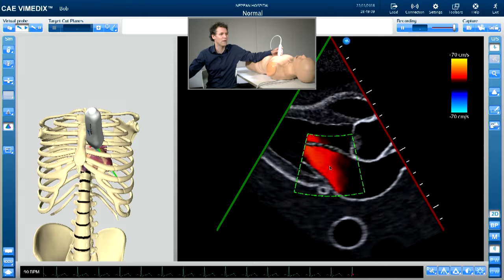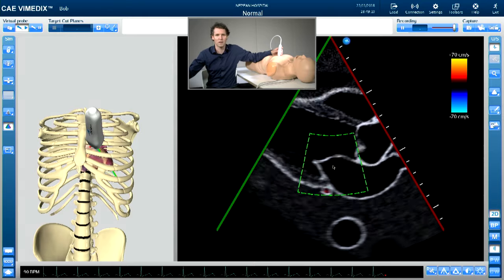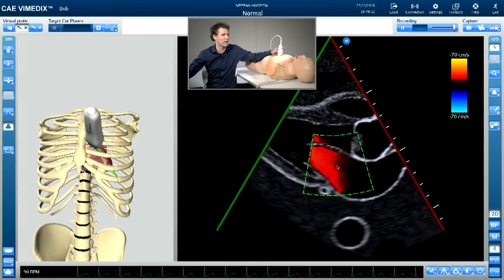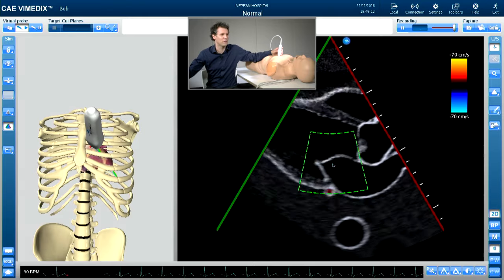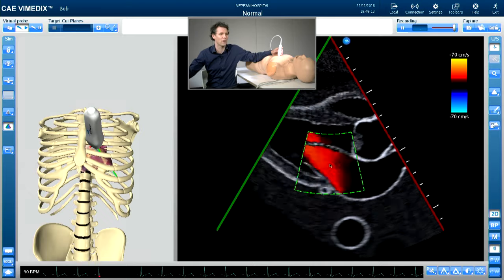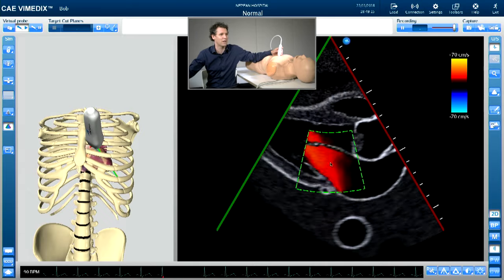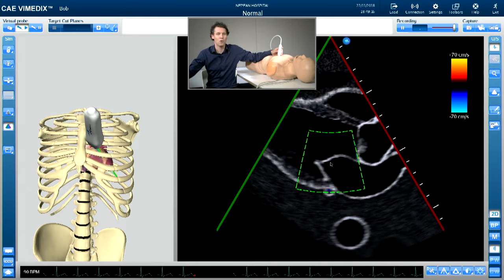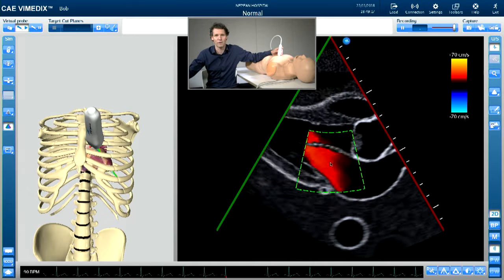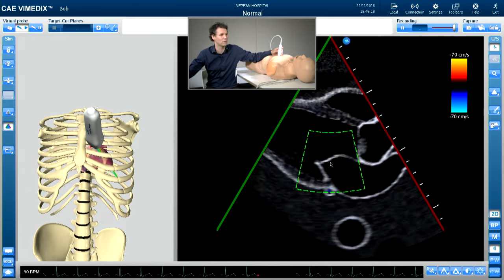You're then going to move that color box down onto the mitral valve to see if you've got any regurgitation going into the left atrium or turbulent blood flow suggesting stenosis.